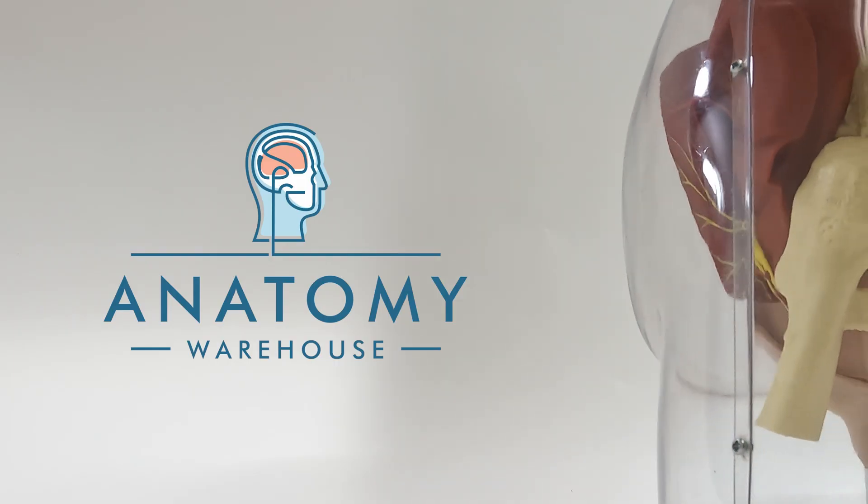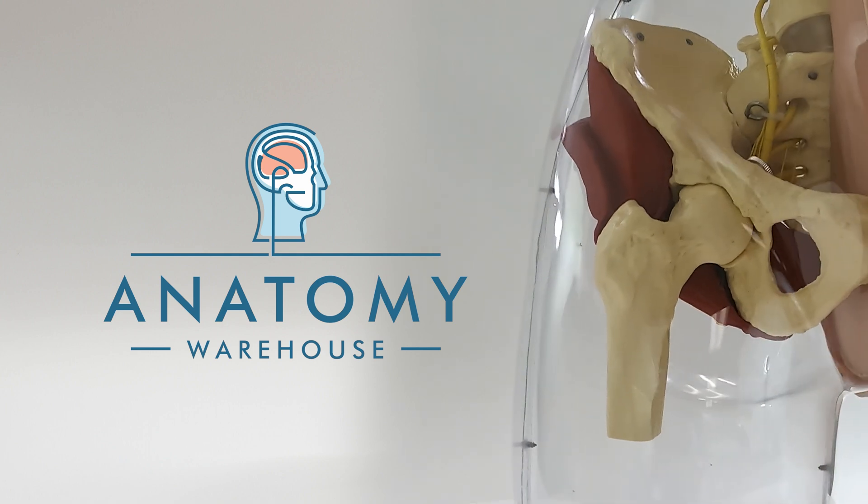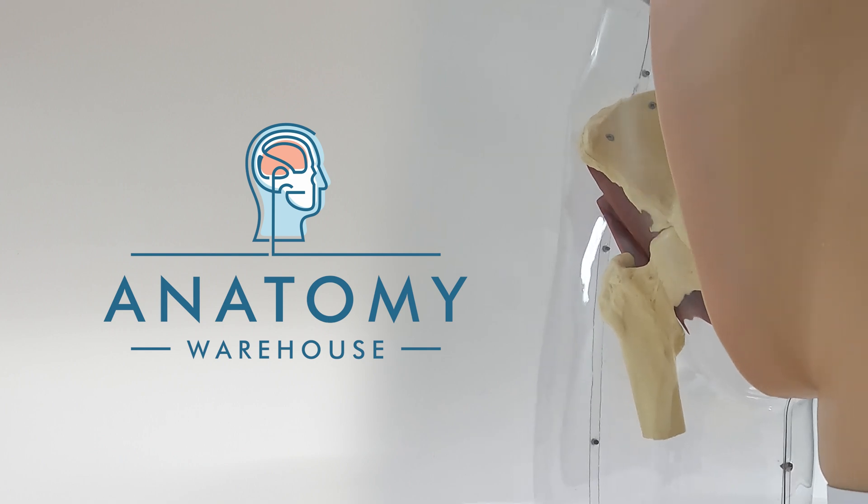Embrace the future of medical education and elevate your injection technique skills with the buttock intramuscular injection model. Available only from Anatomy Warehouse.